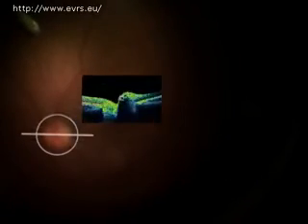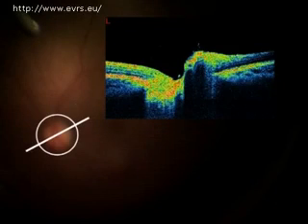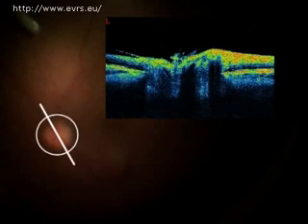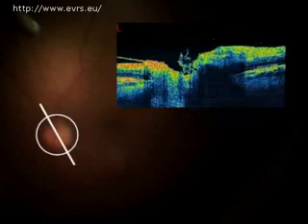We made similar observations in our second case. Spectral OCT sections in different meridians demonstrate that the entry site for blood was probably not only in the center of the disc, but additionally blood spread along the retinal vessels and produced localized ILM detachment.